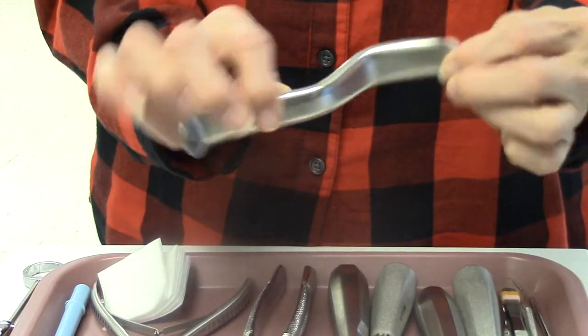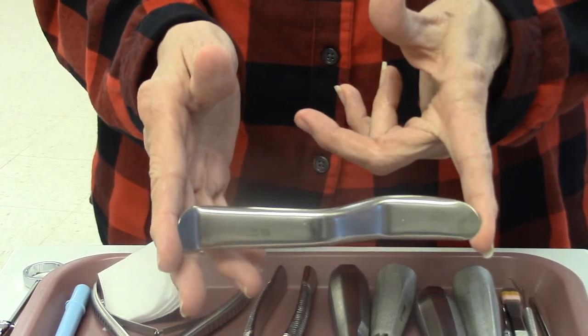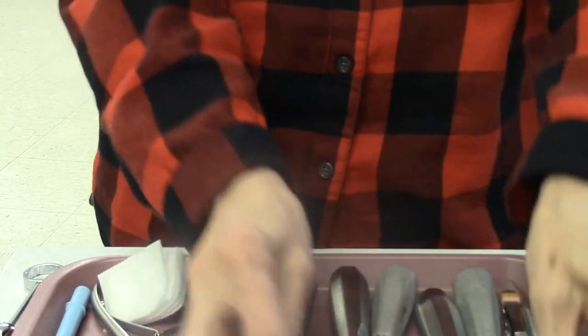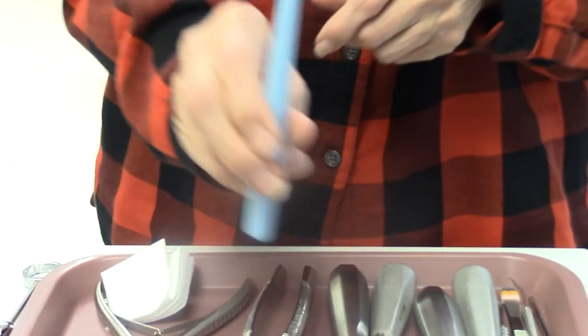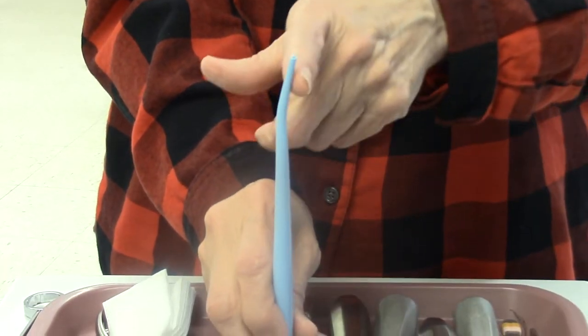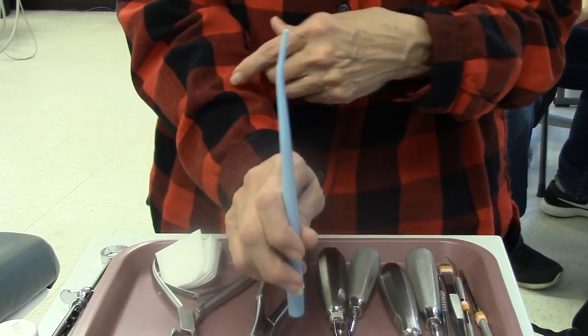This is a retraction device called the Minnesota. It retracts the cheek and the tongue while the doctor is doing the extraction. We also have a surgical suction, and as you can see, the surgical suction has a small hole in it compared to our high-volume suctions.